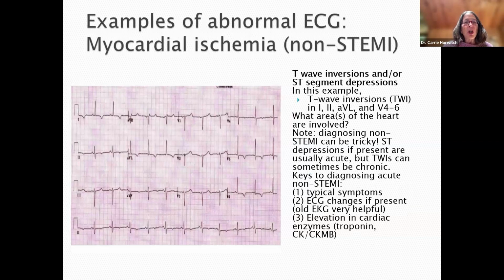And this is what's called a non-STEMI or no ST elevation MI. And here you can see the ST is not up or down, but if you look at other things that are going in the wrong direction, you see T-wave inversions. And there are T-wave inversions in lead 1 and lead 2, which should not be inverted. You also see T-wave inversions in 5 and 6. Those should not be inverted.